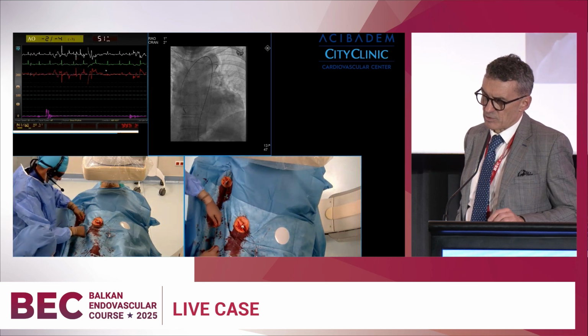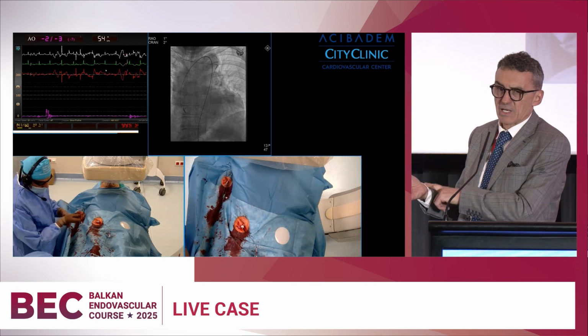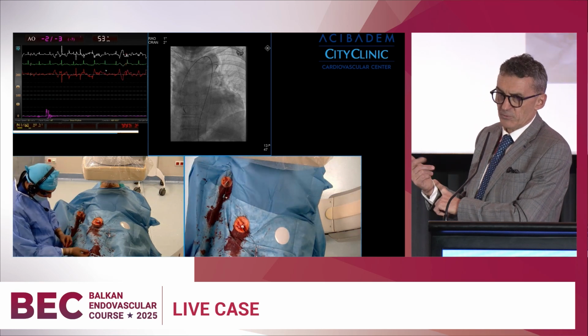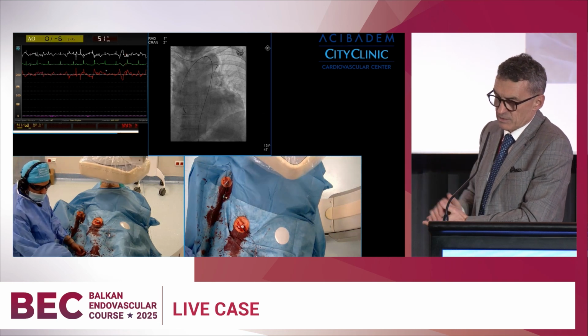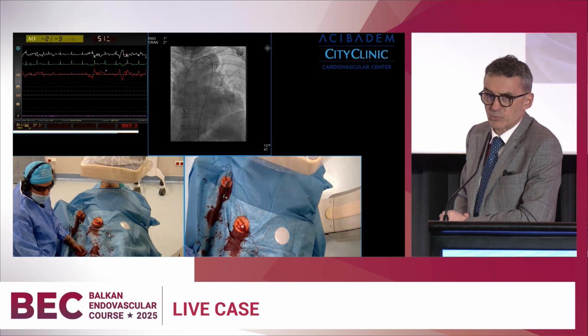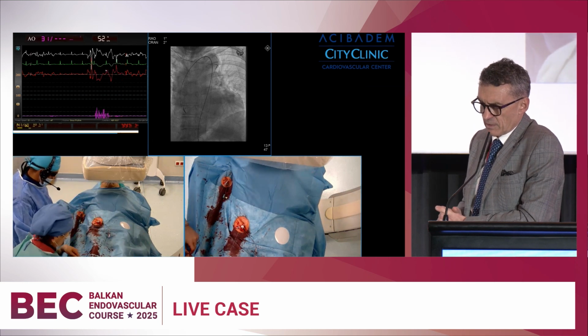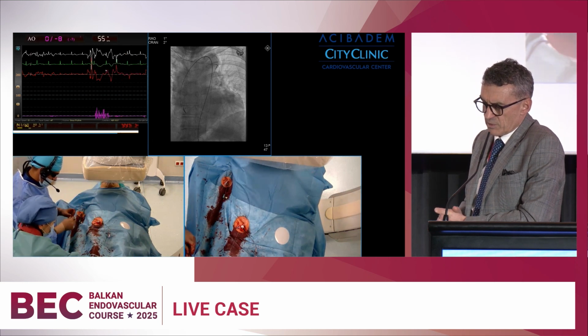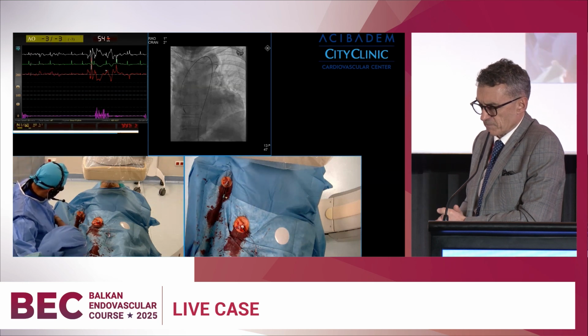In fact, this is our usual approach. Always we have arm approach for angiography, for registration, and in some cases, like in this case, for some manipulation of wires and catheters from above. And of course, the implantations are done from the femoral because of the bigger sheath.